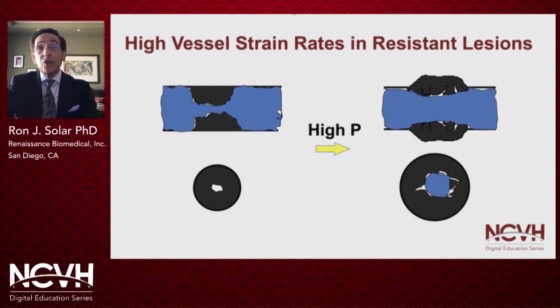And in doing so, the balloon has all this pressure there. It goes immediately to its full size. And like an explosion, this results in a very high strain rate. And often you see very severe dissection and excessive vascular injury.